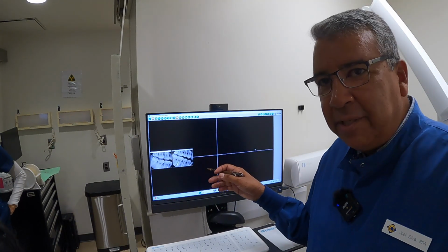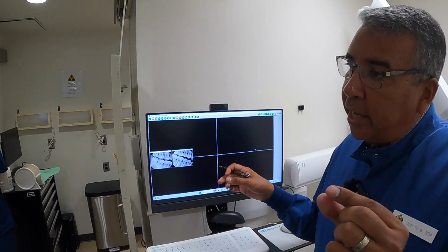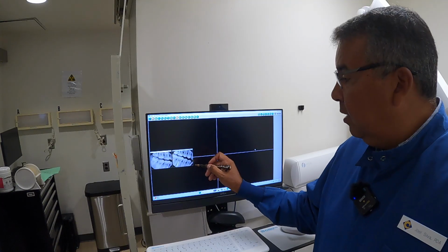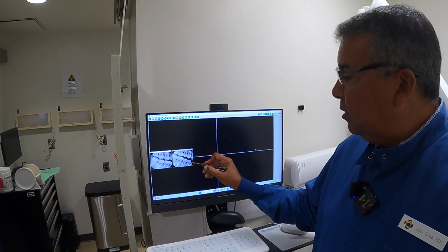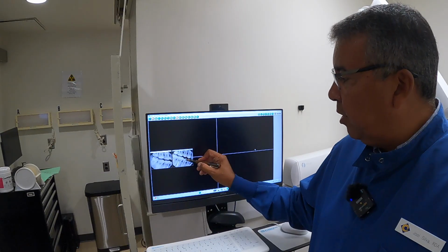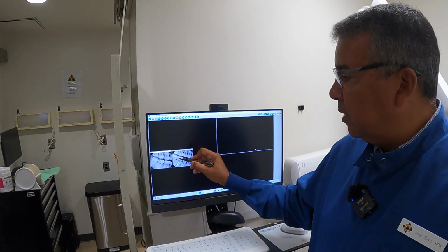I don't know why it says mesial edge, but we're only getting the distal side. Even if I had a little piece of it, I'm pretty happy, because you're showing me the interproximal space. But look, everything's open. Interproximal, interproximal, interproximal, interproximal. This side's a little bit closed, but it's not quite overlapping like something like this.